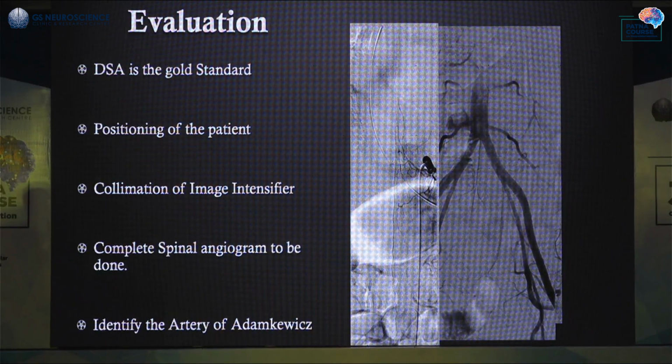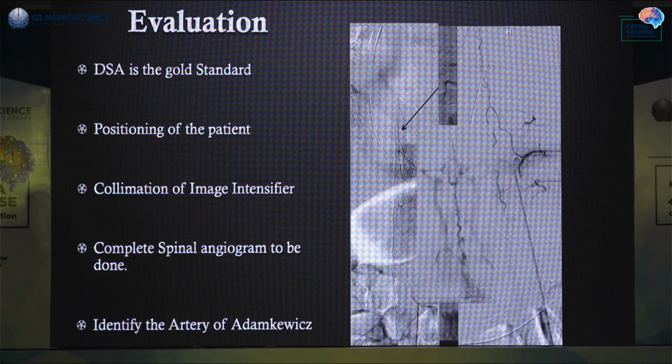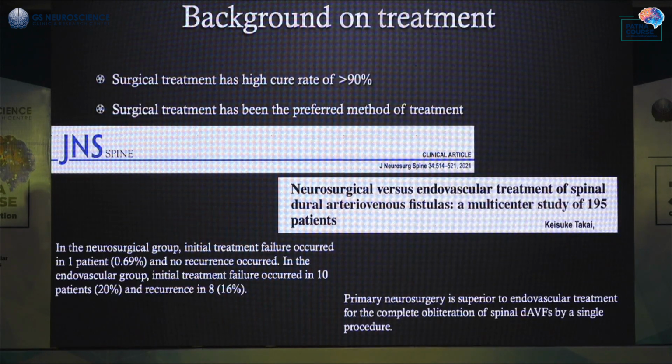Before embolizing, just looking at the fistula, going after it, it's not the right thing to do. You need to always know where your anterior spinals are, and at the end of the procedure, I always recheck on my anterior spinal, I document that it's intact before I come out. And then you also understand your venous drainage, how far it goes.